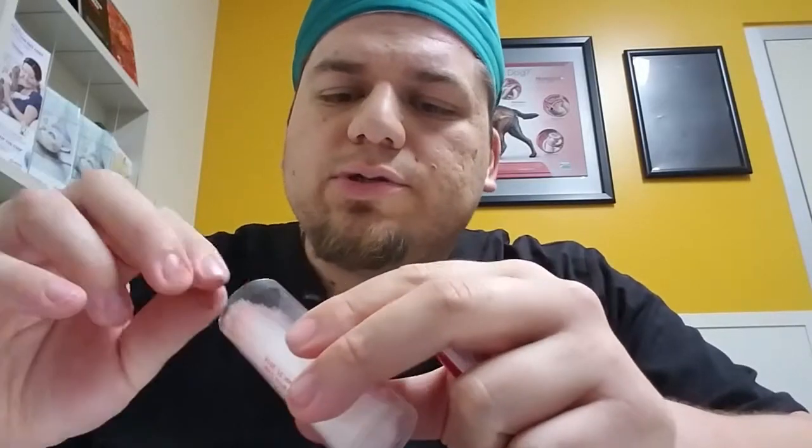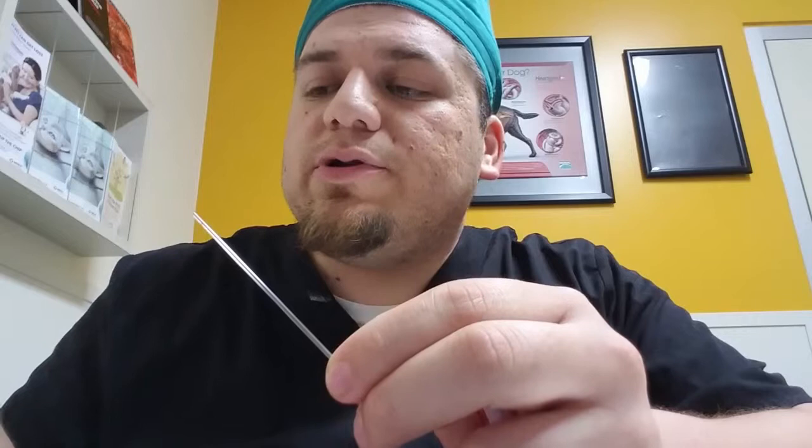I'm going to get a micro hematocrit tube. This one is heparin filled — you can tell with the little red lining right here. I don't know if you can see it on the camera. Just so that it's balanced, I'm going to do two of them.